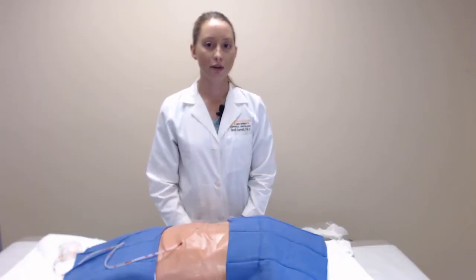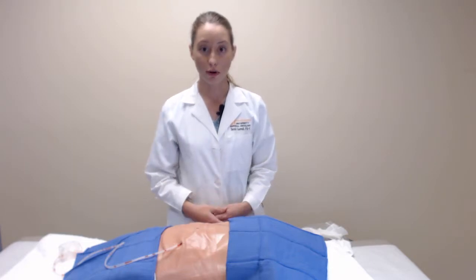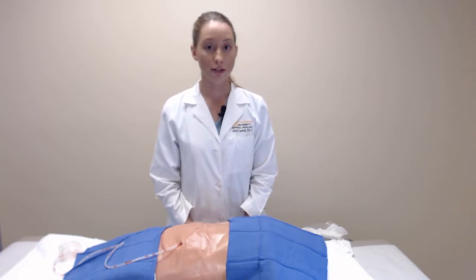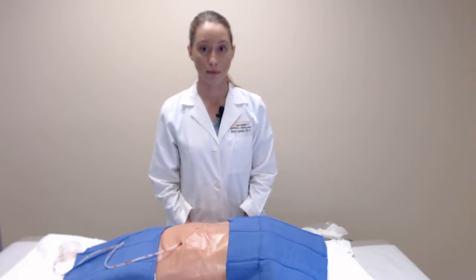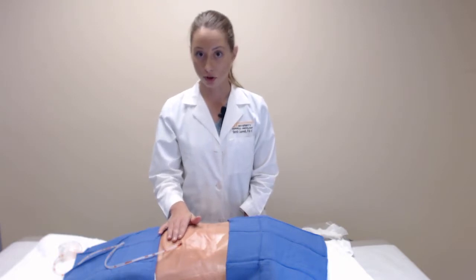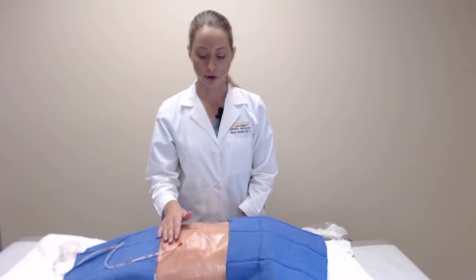Now that we've gone over how to strip your drain, we're now going to move on to the care of your drain site. As we've discussed earlier, you can shower with your drain. It's important when you shower to make sure that you allow soap and water to run gently over the drain site. It is important, though, not to scrub vigorously around the drain site, as this can cause irritation. If there's one day that you're unable to take a shower, it's important to make sure that you take a soft washcloth and gently clean around the drain site to avoid any accumulation of dirt or bacteria around the drain site.